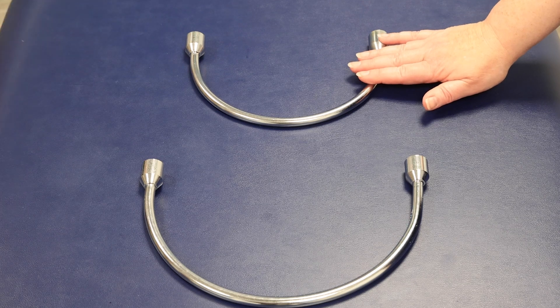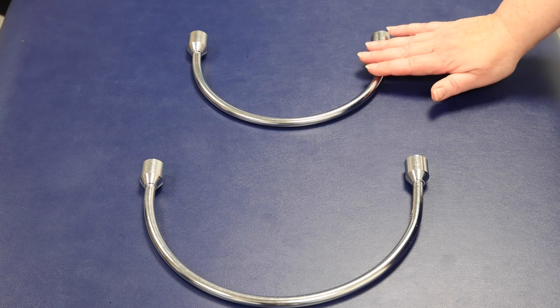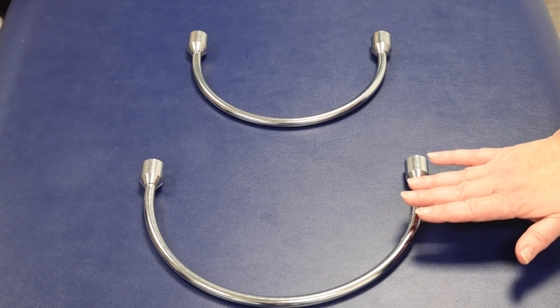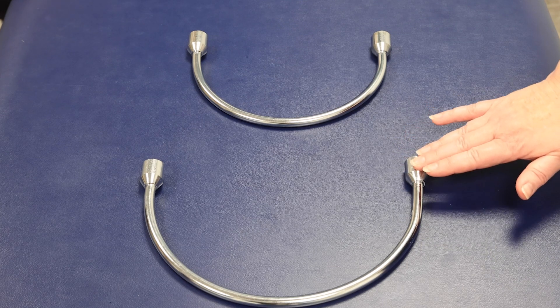Now choose the appropriate ring size. The possible options are size 2, up to 53 centimetres, but this is too small. Size 3, up to 70 centimetres — this is slightly larger, which is preferable to accommodate swelling and prevent pressure damage.